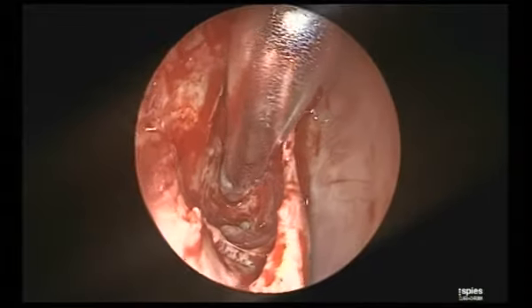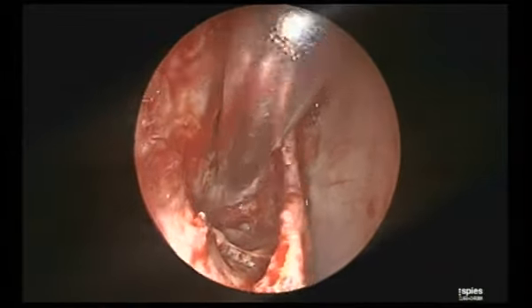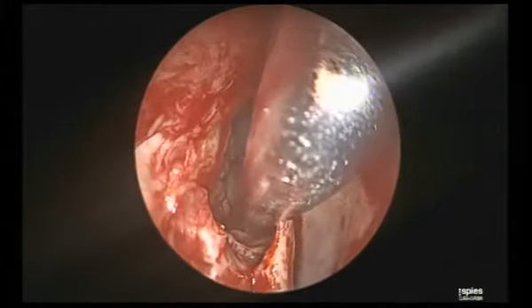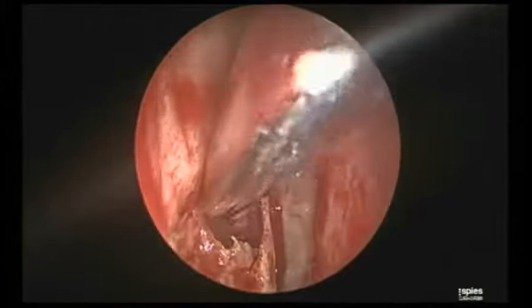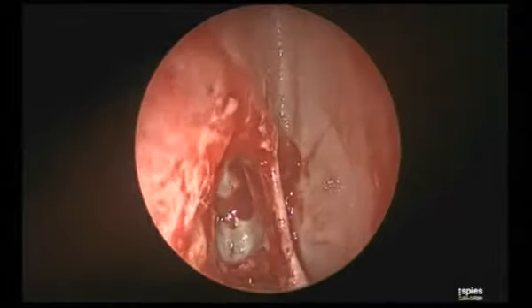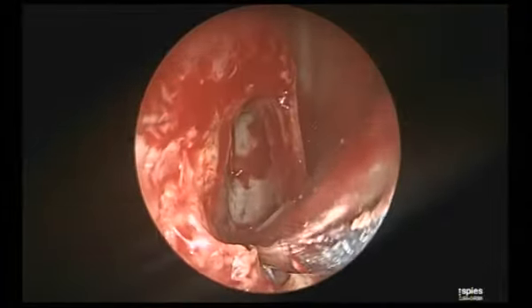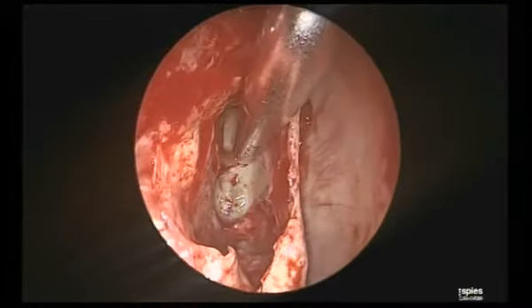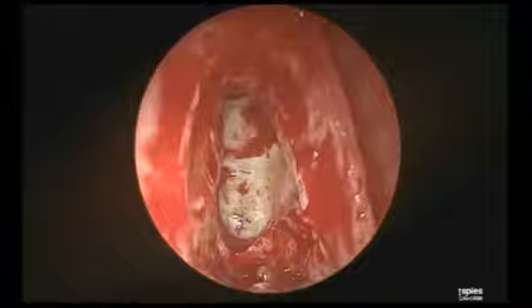This is the place where I use this reverse blade. Fantastic. To flush this anterior ethmoidal artery, this cell behind, up to the anterior ethmoidal artery. Can you see? The next time when Satish is operating, we'll show you the technique of how to engage this blade. Not very easy. It is important. It's not easy, it's not difficult. I would say 0 degree.